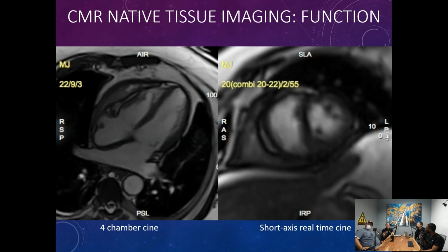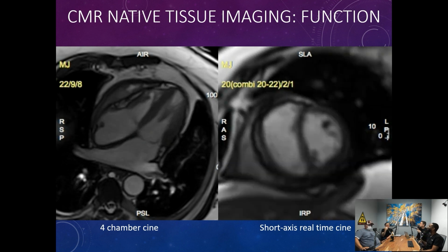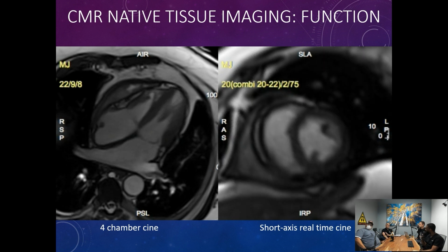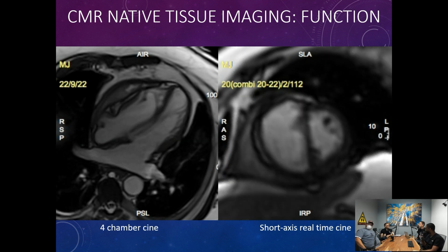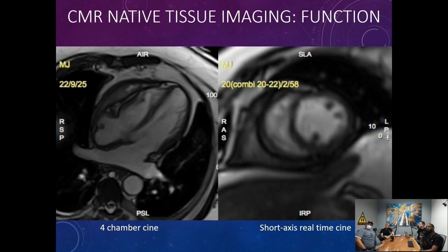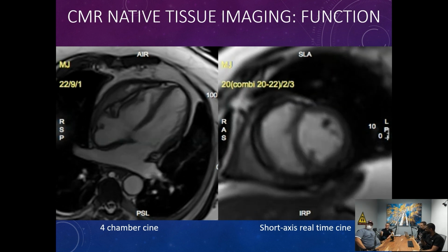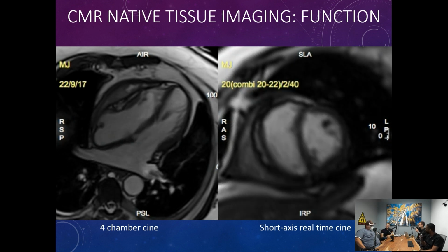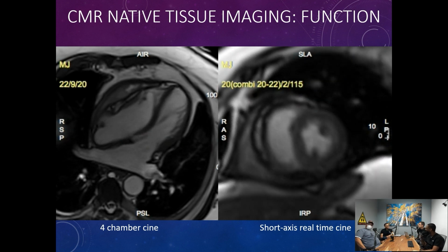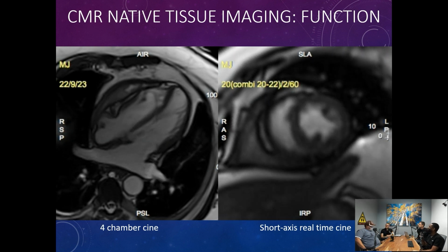So when I see pleural effusion and the function seems to be good, our mind goes there. I'm happy that you brought this up, Robert, because I think it adds to the need for flexibility and to sometimes make changes on the fly when you see something, because you sometimes discover things as you're imaging. So that's why it's important for you guys to communicate with Clint and I, to tell us, hey, I've got some images. What do you think? Are we proceeding as planned? Because we protocol cases, but sometimes surprises happen.